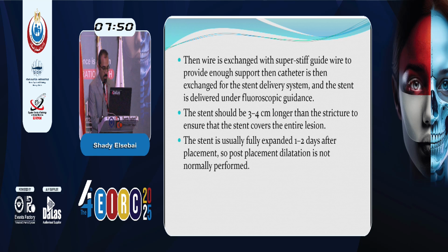Ensure the stent covers the entire lesion. The stent is usually fully expanded 1 to 2 days after the placement, so post-placement dilatation is not normally performed.